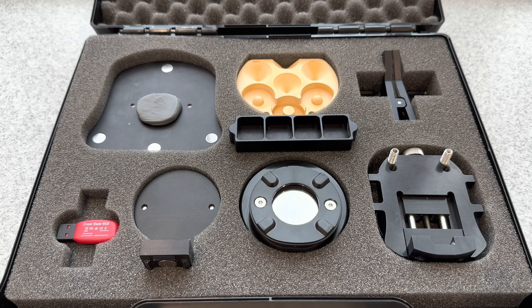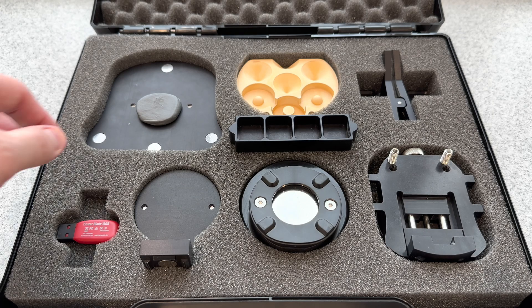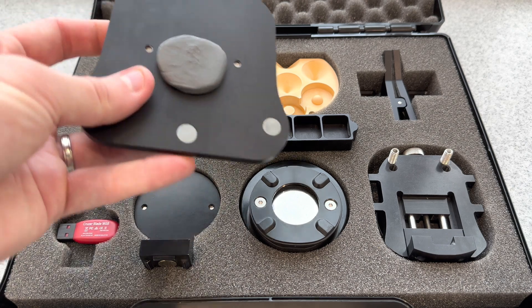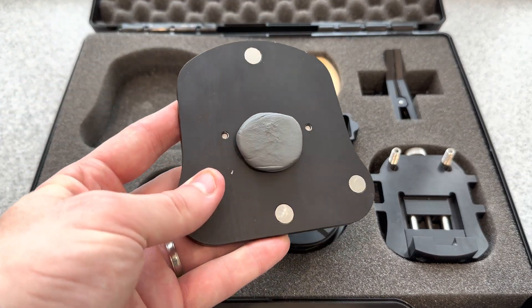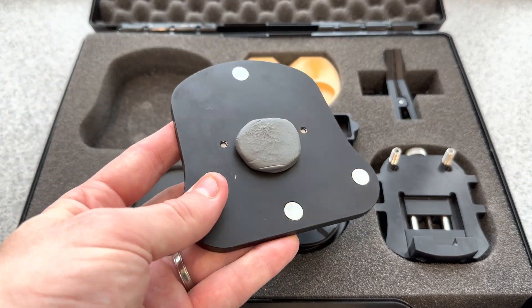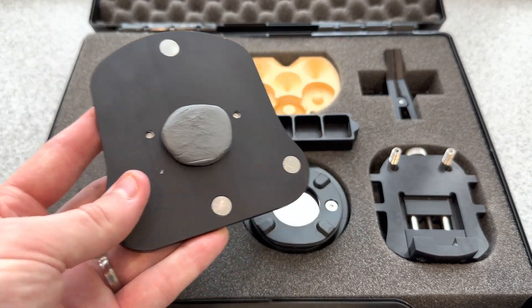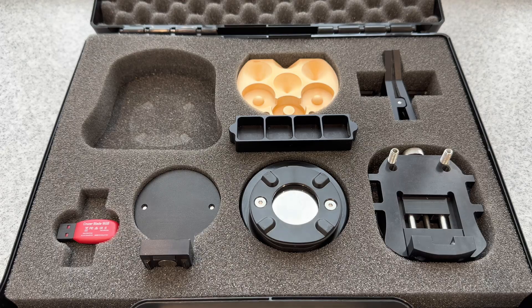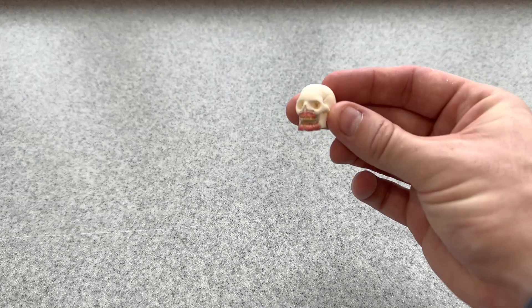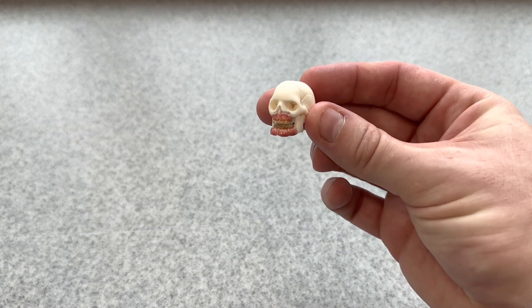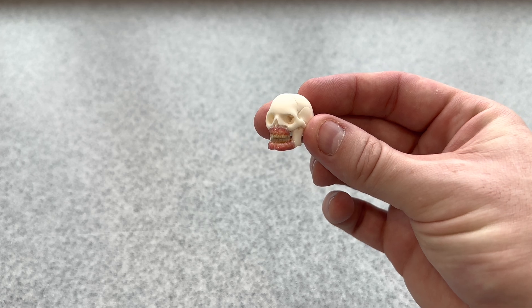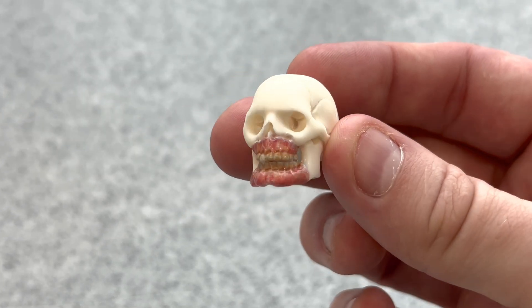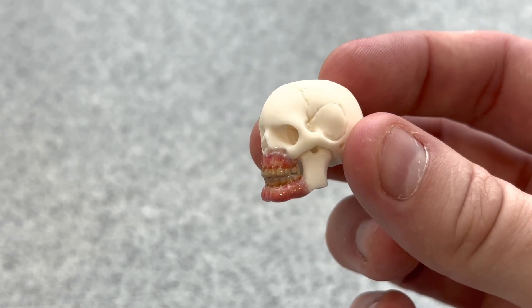For this scan, we're going to be using the Universal Objects Holder, which is located in the upper left-hand corner of your accessory kit. For the demo, we're going to be using this mini skull that was carved out of bone and uses GC Gradia for the teeth.